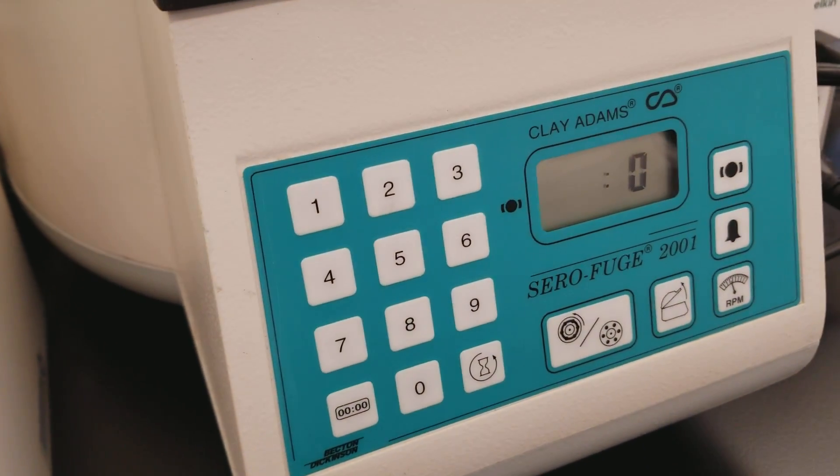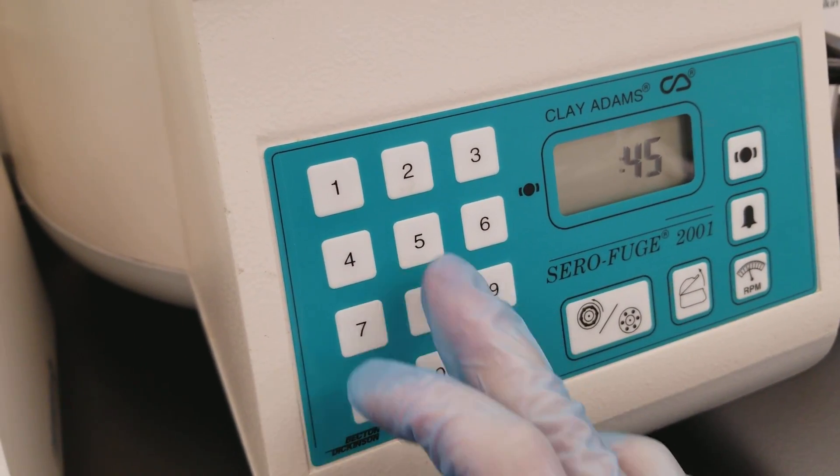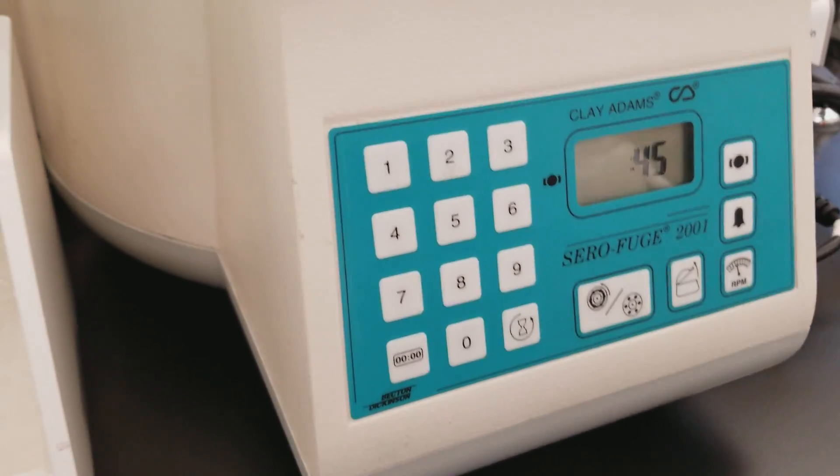The centrifuge runs for 45 to 60 seconds. We'll do 50 seconds instead.